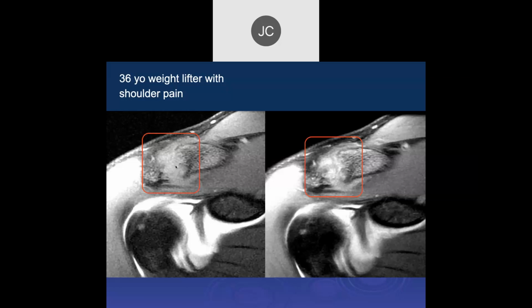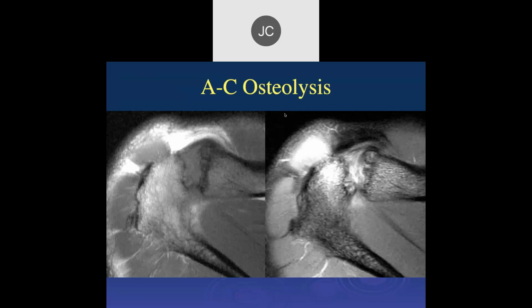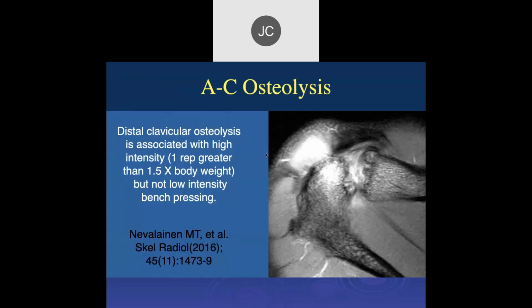And you see, we rarely ever in adults will have an MR scan where the AC joint's normal. Generally, by the mid-20s, most people, the articular cartilage has been eroded away. So this in the past was called osteolysis. People can still use that term, but it was used a lot with plain films. And then here we can see the irregularity and little subchondral cystic changes, erosive changes, and this is just repetitive trauma producing osteolysis and degenerative disease.